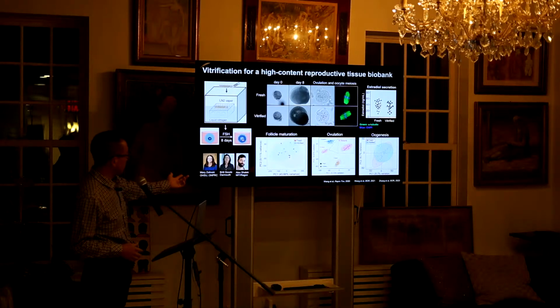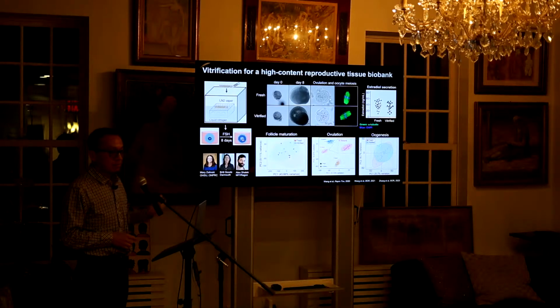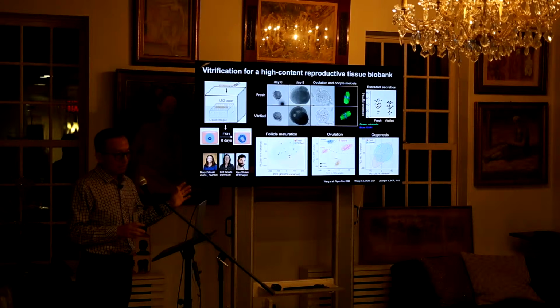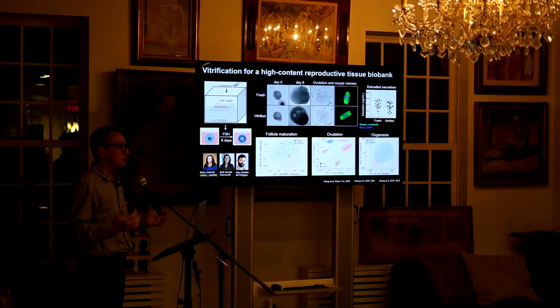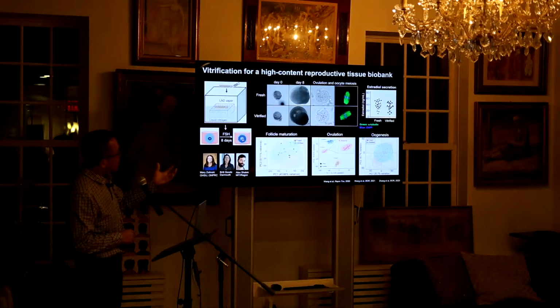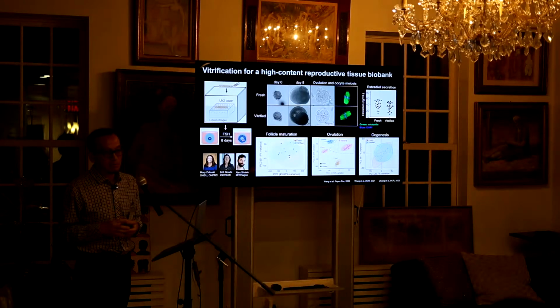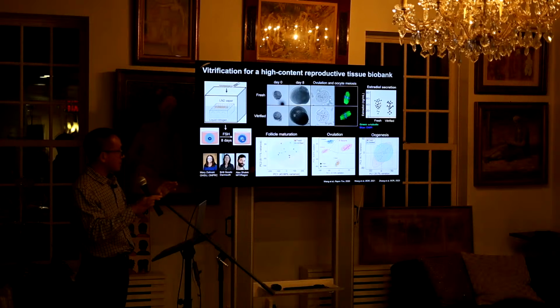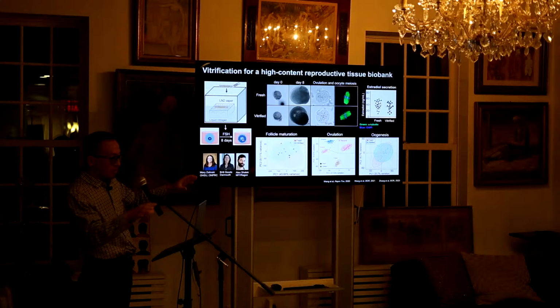So we collaborated with Dr. Mary Zelinski from Oregon and developed a closed vitrification system. So far it works pretty well in mouse follicles, because I don't have human follicles from premenopausal ovaries to do the research, which is very challenging. But overall, for mouse follicles, they are very comparable at the morphological level, meiosis level, and hormone secretion level, and we also did single oocyte RNA sequencing and follicle sequencing, and they are very comparable.